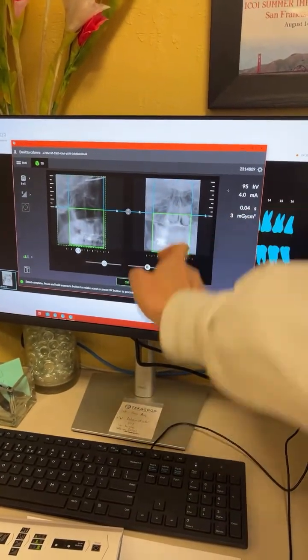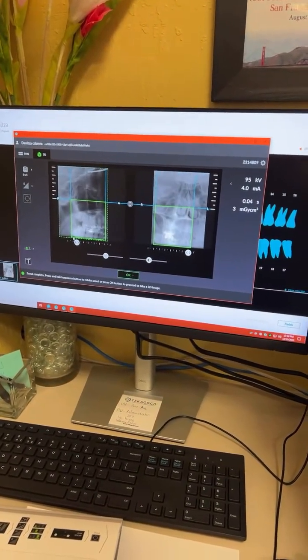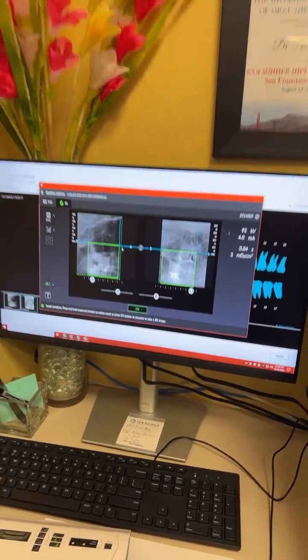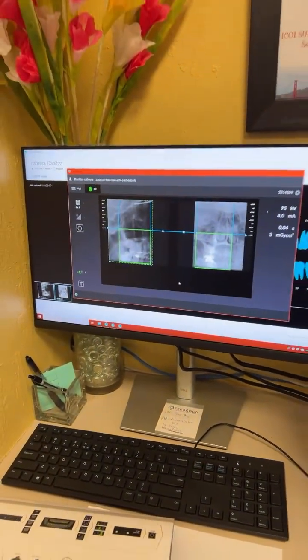I know specifically what I want. I want to move. That's what I want. And this one, does that look good? Okay. Hit it. Okay, all right. Thank you. Now we're going to do the real thing.